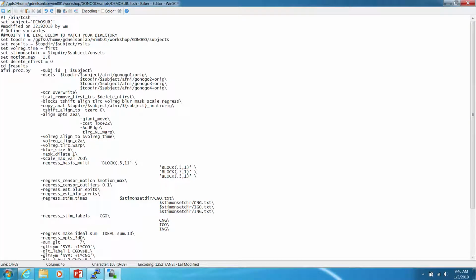And just a rapid review, we tend in fMRI experiments to break things down into runs because it gives brief breaks for our subjects. If something goes wrong in any one of the runs, we have more leftover data, and it has a little bit better properties in the scanner.